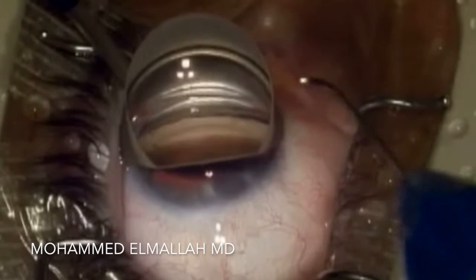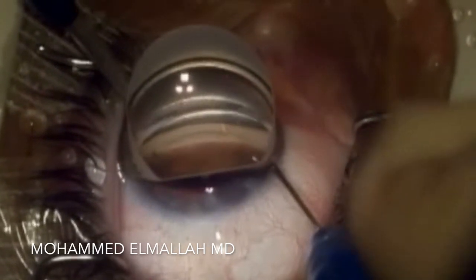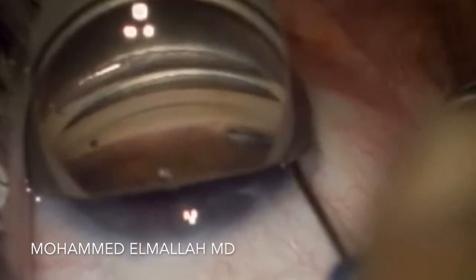A new incision is made to the right of the primary incision, and this is where the Hydrus device is inserted through. This is of course done under direct gonioscopic visualization.